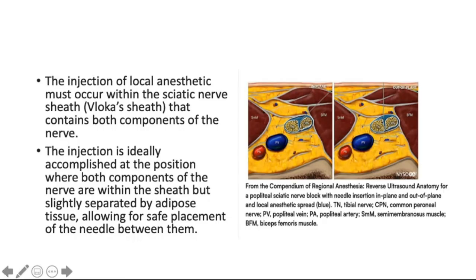For the second question, you mean sometimes the image is not so great, right? Yeah. That's why one of the methods is to invest in a better ultrasound machine. And also we must improve our skill, because it's operator dependent. We can also use a nerve stimulator to better confirm it. Especially in obese patients, even with this popliteal approach, we can't really see it very well.